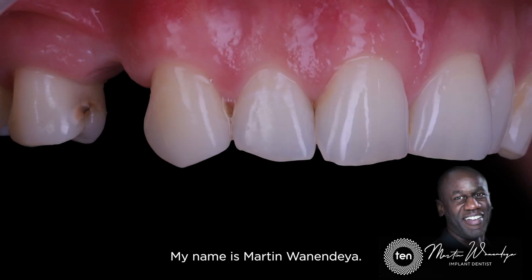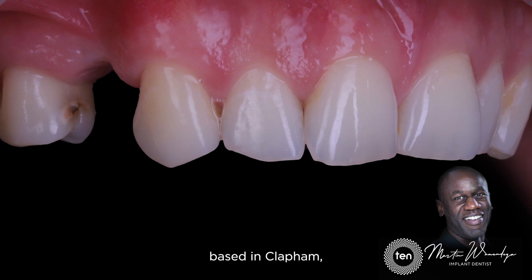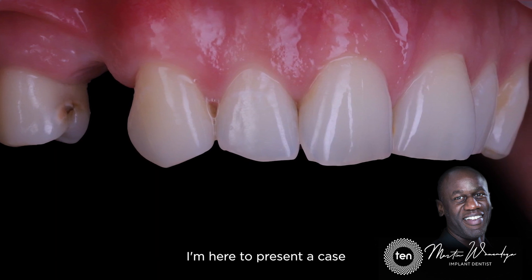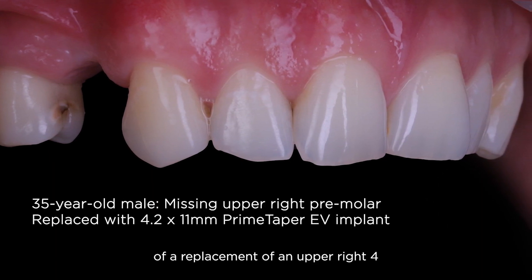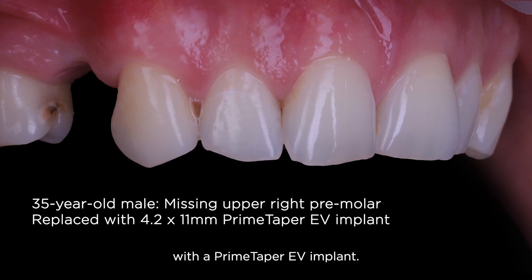My name is Martin Wanendaya. I'm a dentist with a practice limited to implantology based in Clapham in southwest London. I'm here to present the case of a replacement of an upper right four with a Prime Taper EV implant.